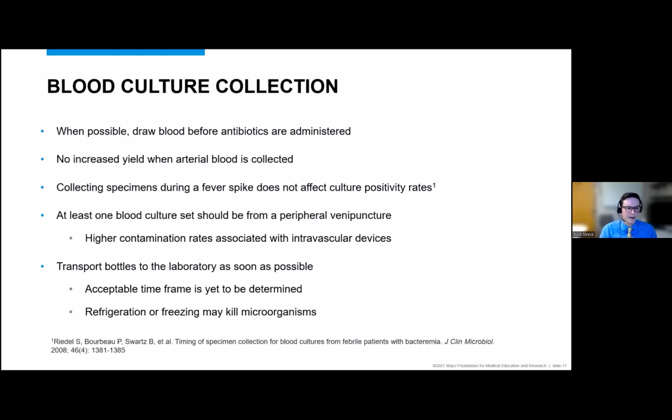We also do get quite a few questions about collecting the blood cultures during fever spikes, and I think that comes from the fact that there are some microbiology testing, particularly in some of the parasitology testing, where there are recommendations for collecting samples during fever spikes that increase the performance of the test.